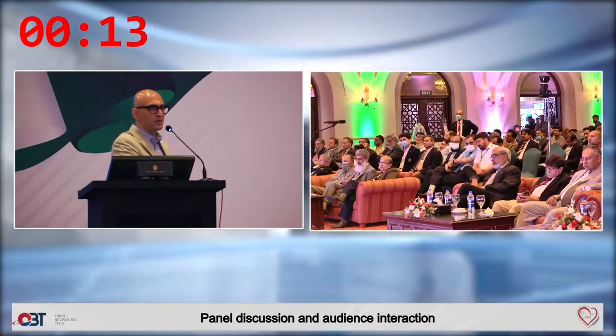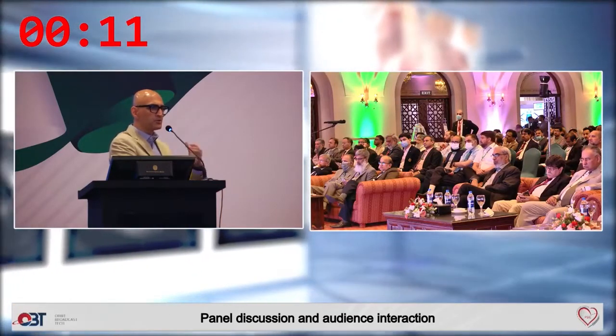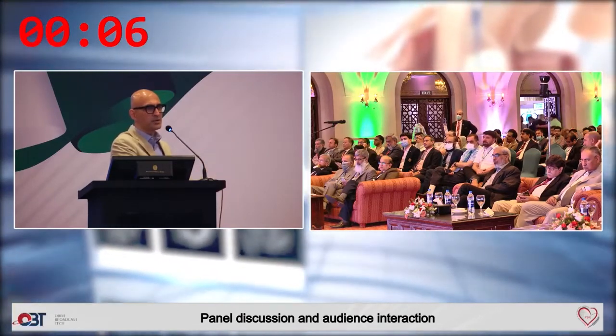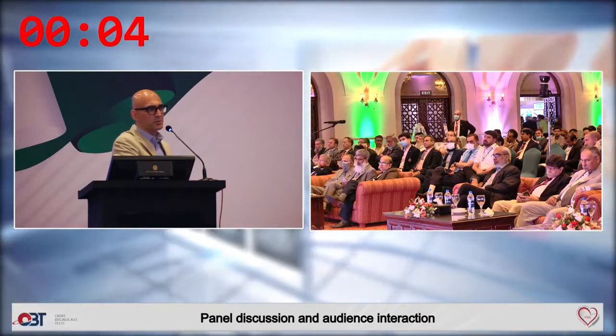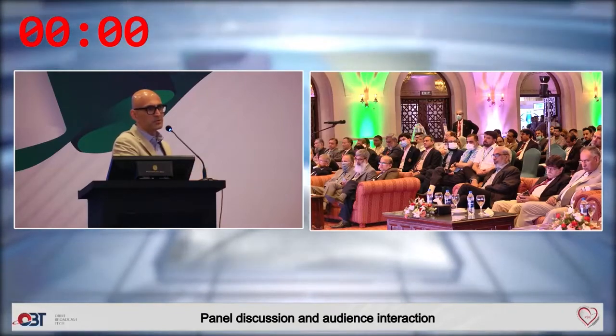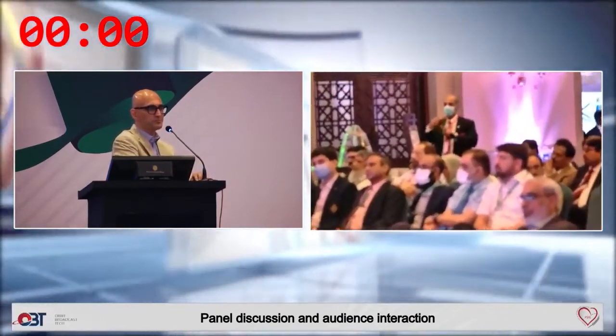We are moving more towards hybrid labs as the procedures between cardiac surgery, vascular surgery, and cardiology become more and more integrated. So I think we're going to move in that direction more and more, and not so much biplane, because so much is already planned out on the CT scan. You already know a lot of the angles and the anatomy. So we're looking more towards a hybrid lab room than getting a biplane. But a hybrid lab is a totally different ballgame.